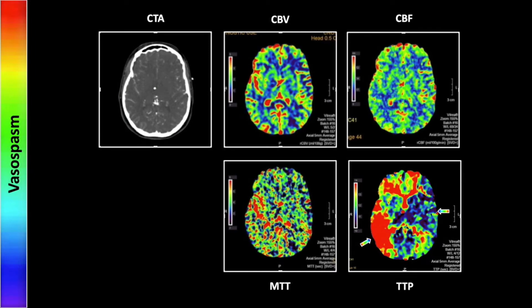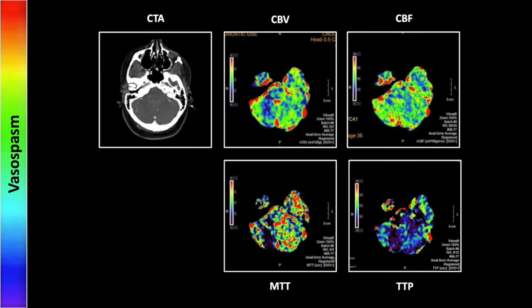Next let's look at this case of vasospasm. There's very little abnormality in the top row — the CBV and CBF, perhaps a little asymmetry in the CBV. The MTT, as we've come to see, is not always that reliable from a sensitivity standpoint. It's the TTP that really tells the story here. There are regions of markedly increased time to peak and markedly decreased time to peak — a striking regional heterogeneity that really has the appearance one would expect from vasospasm.